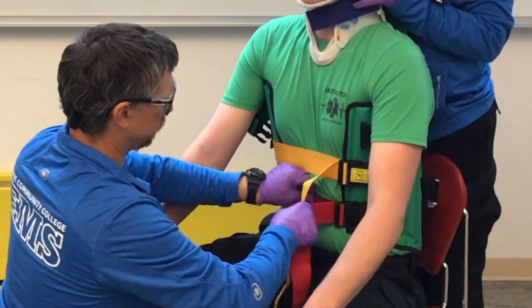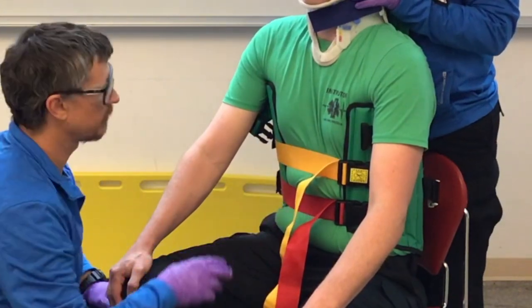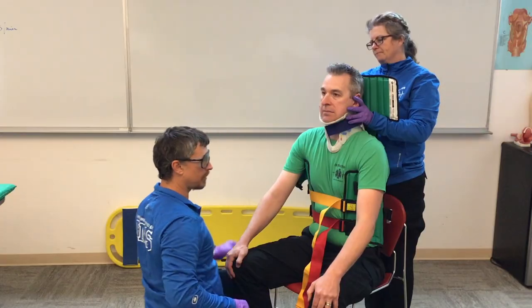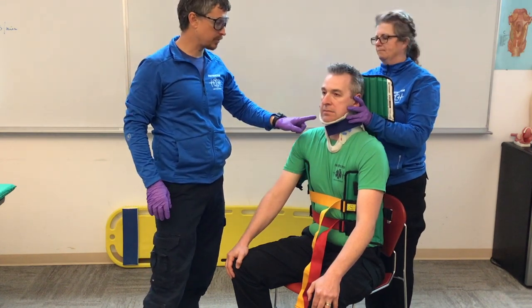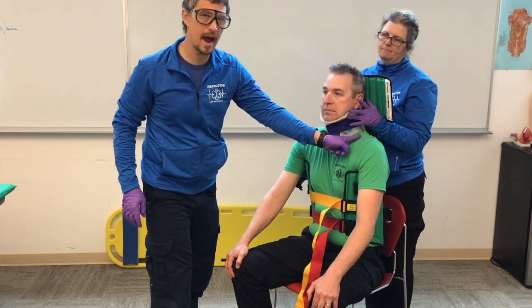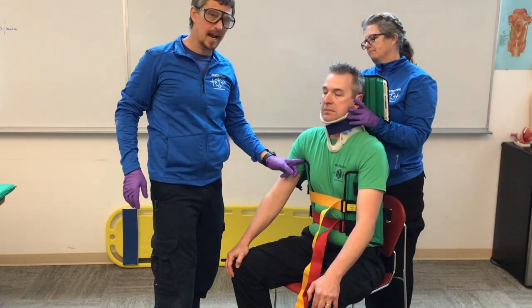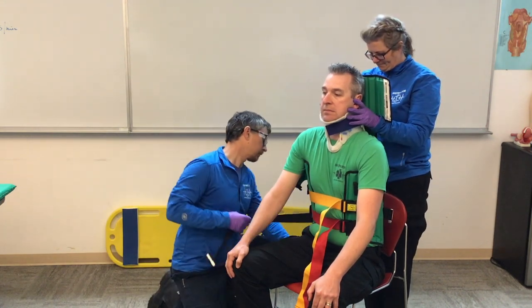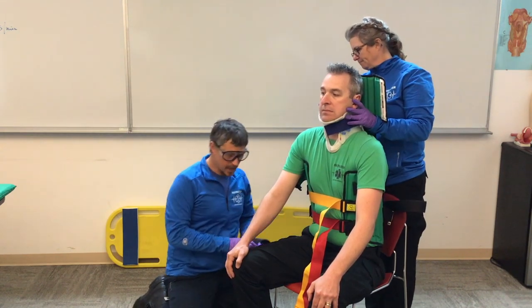Now that I have my middle and bottom straps done and the KED is high and tight in Chandler's armpits, I'll move to the leg straps. If you don't get it high and tight in the armpits with someone tall like Chandler, the head protection is going to hit his traps and you won't be able to close it — or if you go to lift the patient, it's going to slide up.